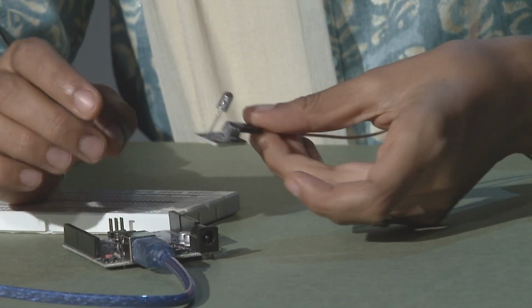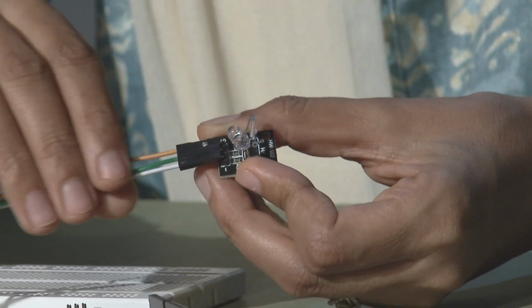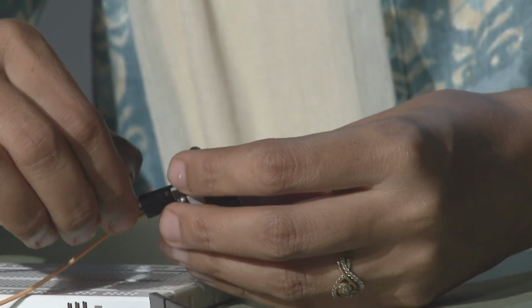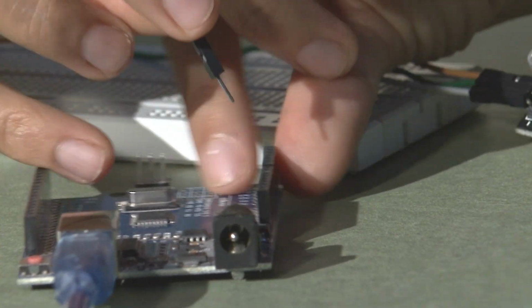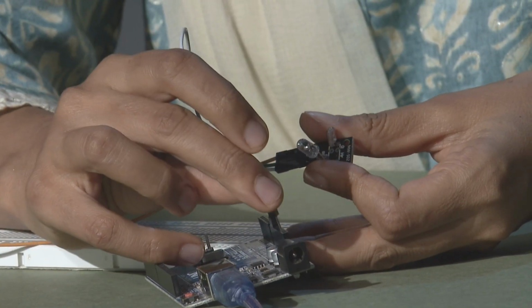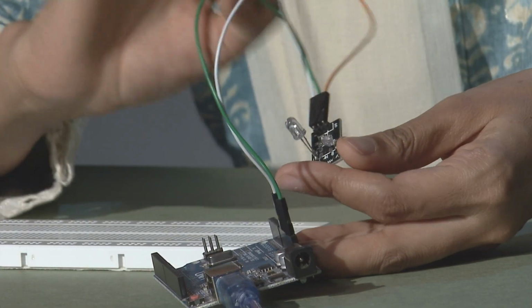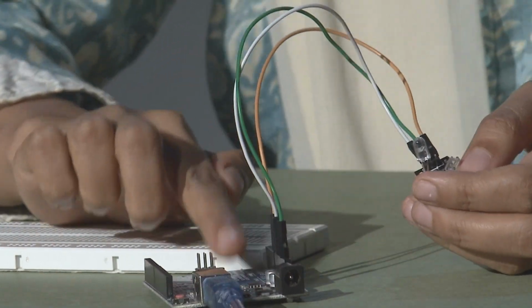Let us first of all create the hardware connections. As you can see, I have brought one Arduino for you, and along with this I have the same pulse rate sensor that I will be using with these 3 pins for connection. First of all, I have this white wire that I have used here for the ground terminal, and on the board I am connecting it directly to the ground terminal. Similarly, the other one is for the VCC terminal, which I will be connecting right here on 5 volt, and the last one is your signal pin, which is also written on the sensor as S. The same pin I am taking and using on any of your analog pins over here. This will complete your connection.